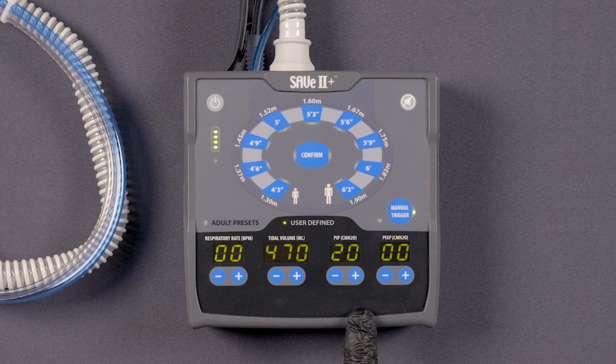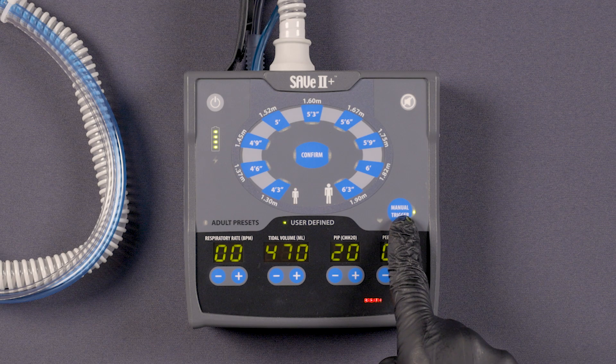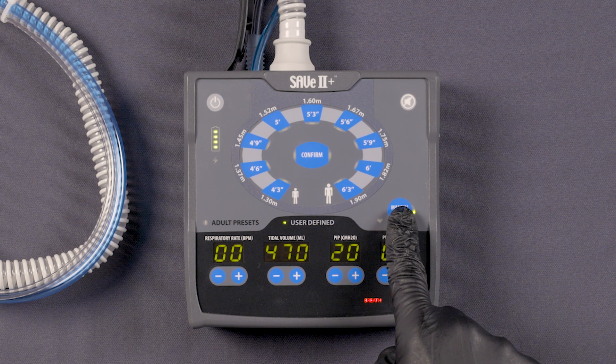While doing compressions, the device will alert you when to manually provide breaths. When alerted, provide breaths by using the manual trigger button shown here.